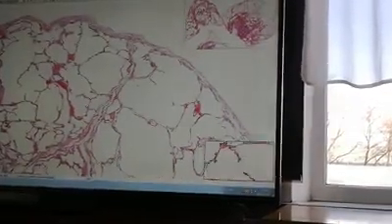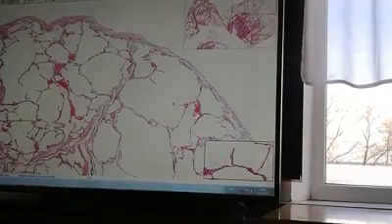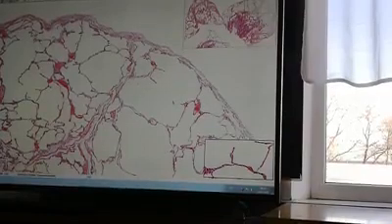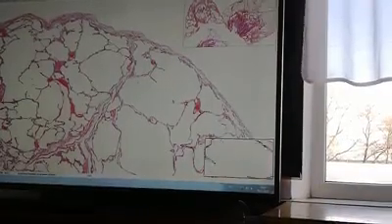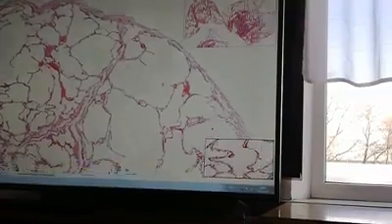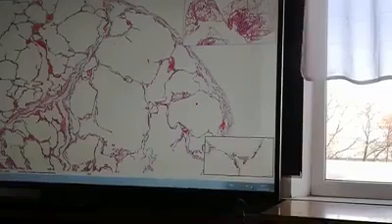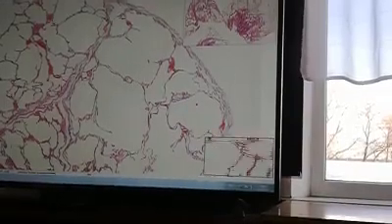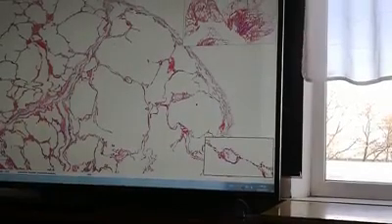Let's see. We can see distended, increased in size alveoli with ruptured interalveolar septa. When the septa become ruptured, like here and like there, alveoli will transform into so-called bullae. A bulla is a large bubble filled with air with disrupted interalveolar septa. And you can compare. These alveoli become over-distended, emphysematous, and for example, those alveoli are almost normal. Compare the sizes. That's why we are talking in this preparation about emphysema.